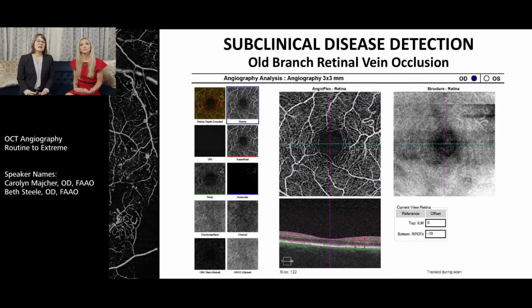So we'll see in examples later that OCT angiography can be very useful in the case of an acute vascular occlusive event, whether it be artery or vein occlusion or ischemic optic neuropathy. But it's also very useful in the case of an old event, an event that's occurred previously where you have some confusing evidence, you're not exactly sure what the etiology may be of reduced acuity or poor visual function or other vascular changes.